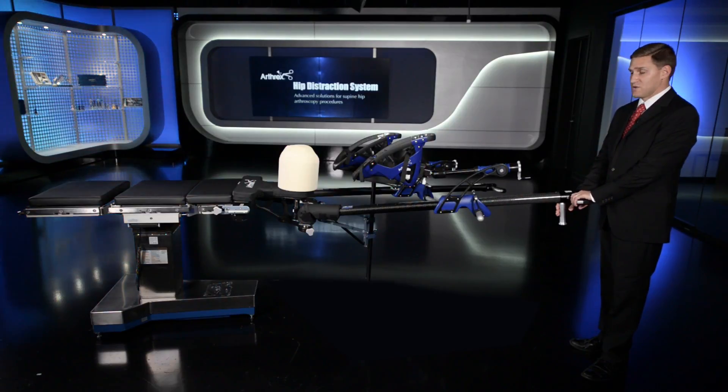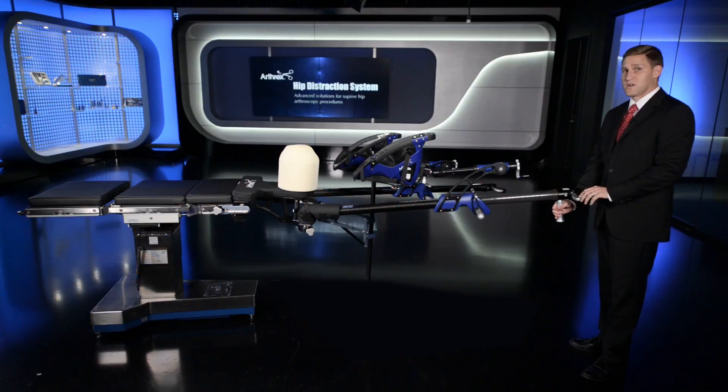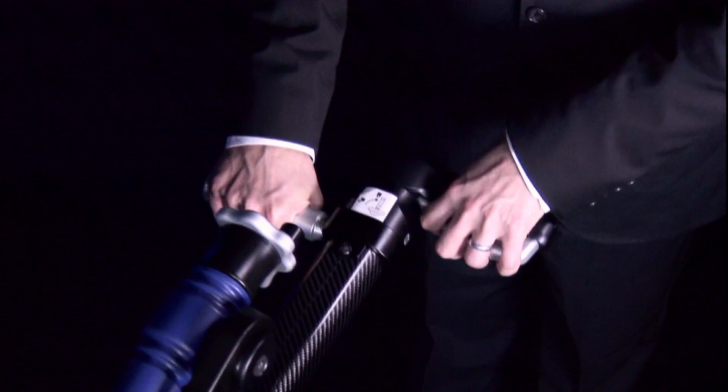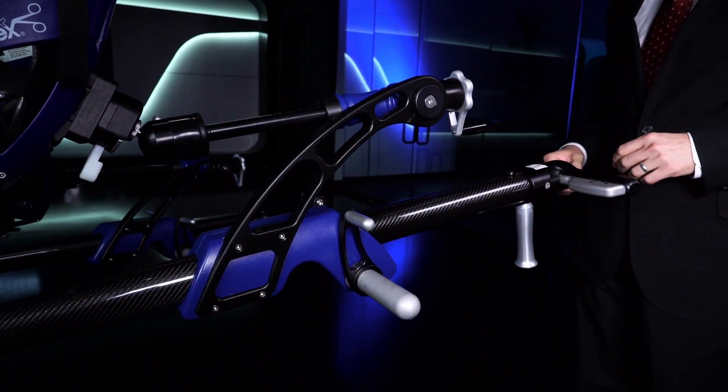Your abduction and adduction are controlled here by squeezing this trigger. Your flexion and extension are controlled by the undersurface lever via pulling down and counterclockwise to release it, to be able to flex and extend your hip joint. To lock it, you simply pull it out and down to lock the joint in place.